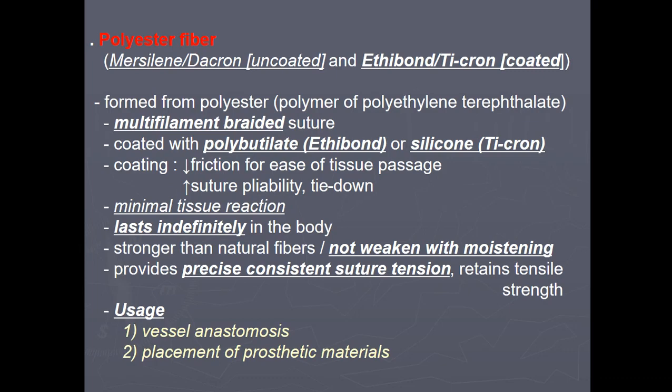Another one is a non-absorbable synthetic suture material, polyester fiber. It is formed from polyester, a polymer of polyethylene terephthalate, multifilament braided, and coated with polybutylate.